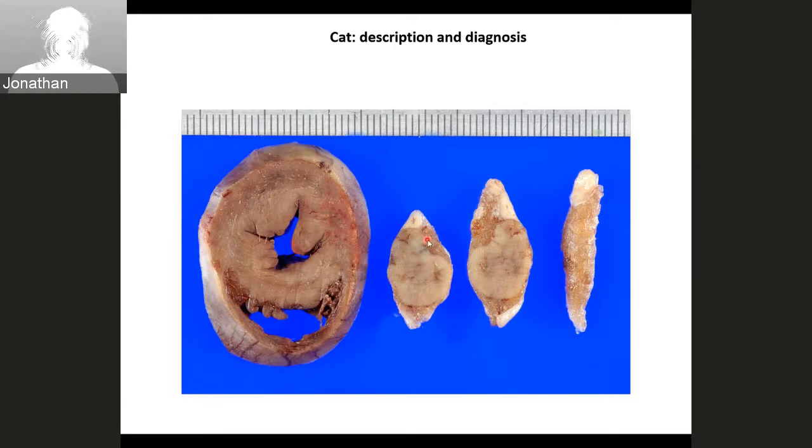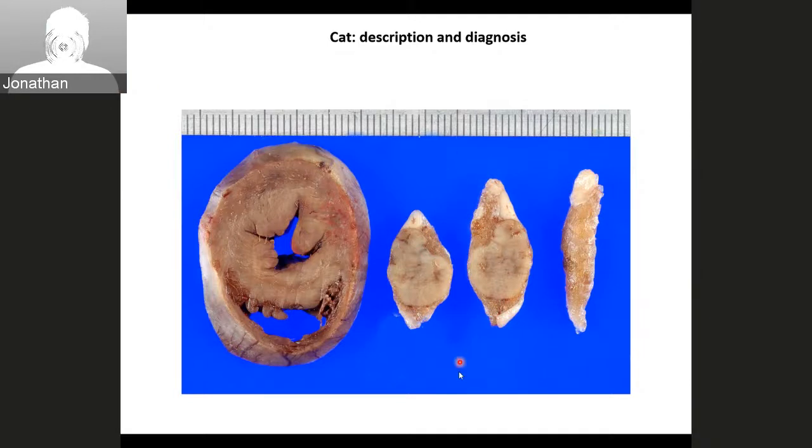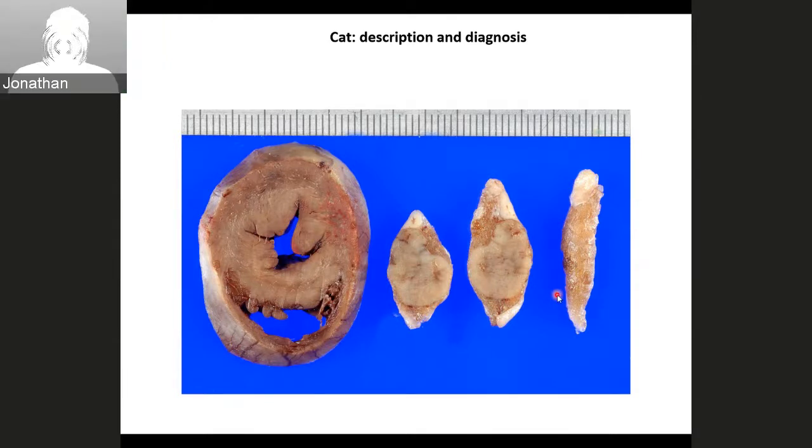Take care, because this one is the same thyroid gland. I cut in the middle. That's normal. But this one, at the external examination, there was an enlargement, and so I cut in the middle, and so I can appreciate the nodule. Okay, sorry, I thought it was two, you compared with the normal, and you had the two from the cut. So enlarged thyroid with a nodule within the thyroid.